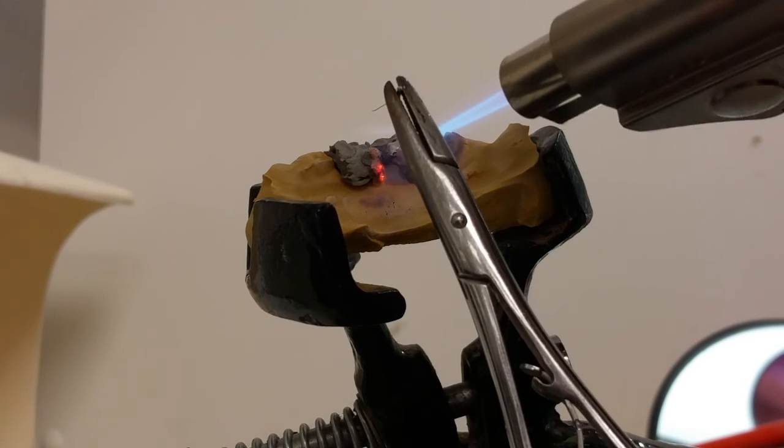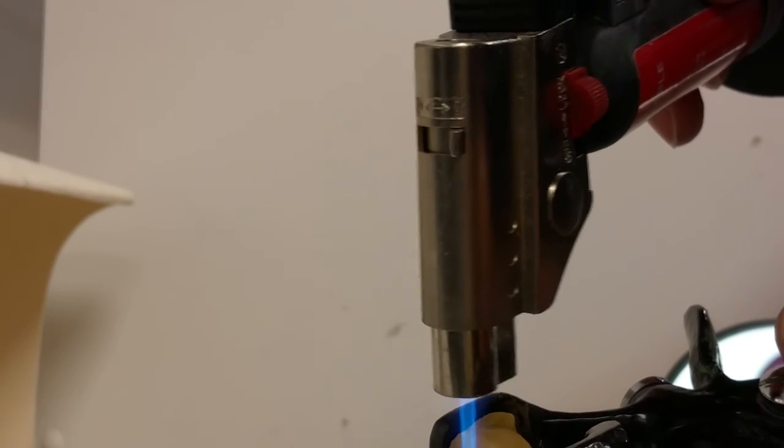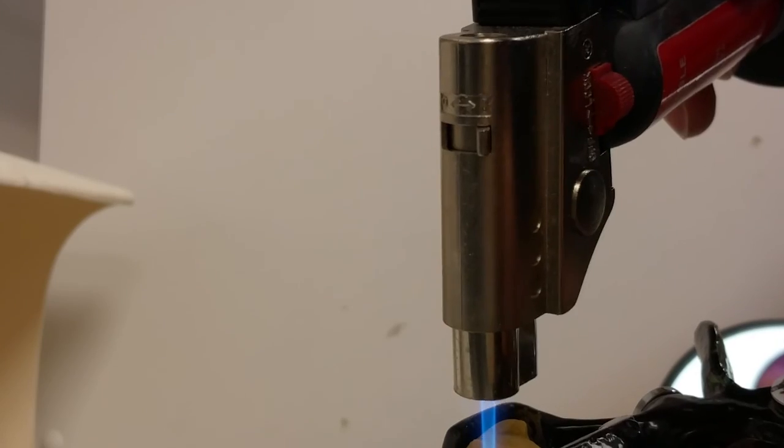Sometimes if it relaxes too much and goes too close to the gingiva, you'll see I'll flip this thing upside down. I'll use gravity to my advantage, heat up the solder again, let it relax, and go toward the occlusal. That way there's not impinging gums and stuff.